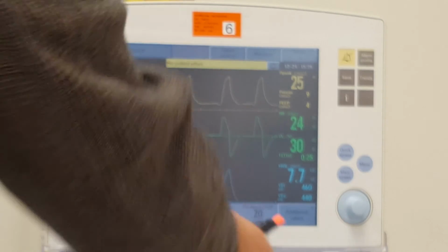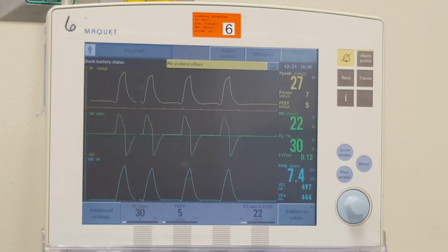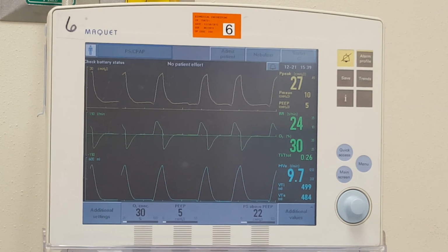460. So we are actually going to have to double it. There we go. We're back just over 500, right around 500, which is where we started. 510, 499.